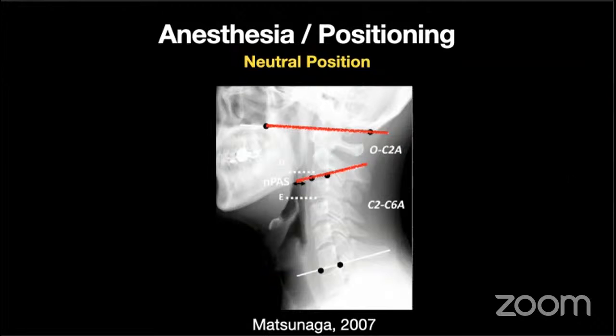It should never ever be kyphotic or lesser than your preoperative angle. So always measure this angle preoperatively as well. So I'll go to the surgical video.